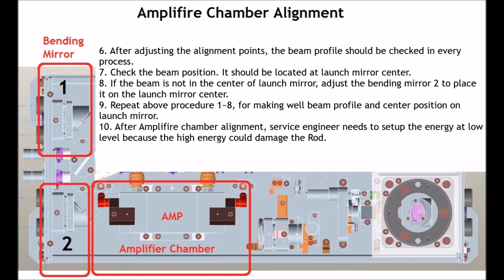8. If the beam is not in the center of the launch mirror, adjust the bending mirror 2 to place it on launch mirror center. 9. Repeat above procedure 1 to 8 for making well beam profile and center position on launch mirror. 10. After amplifier chamber alignment, service engineer needs to set up the energy at low level because the high energy could damage the rod.